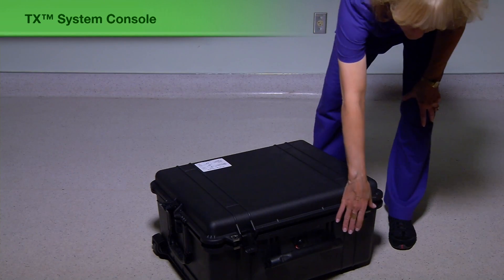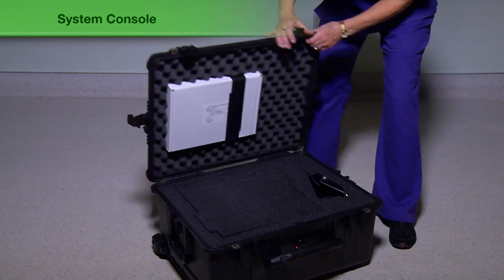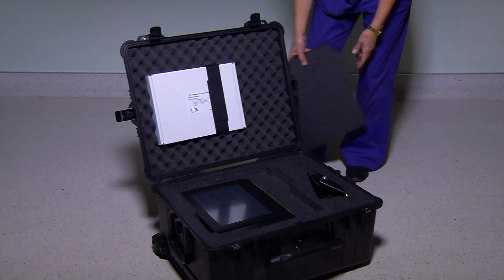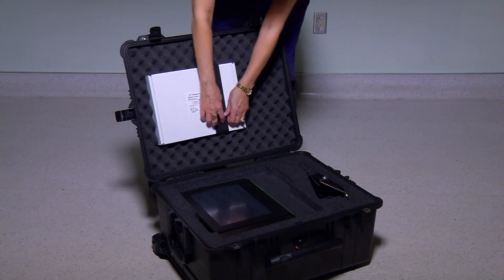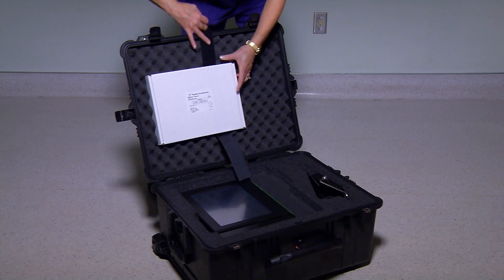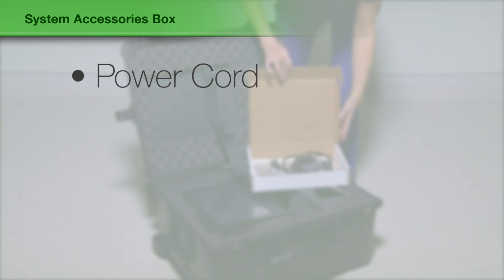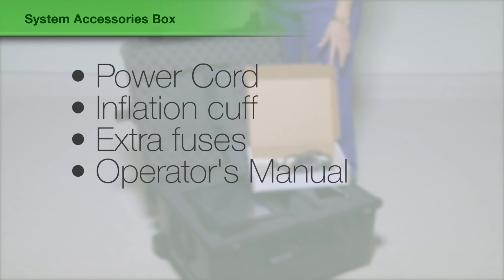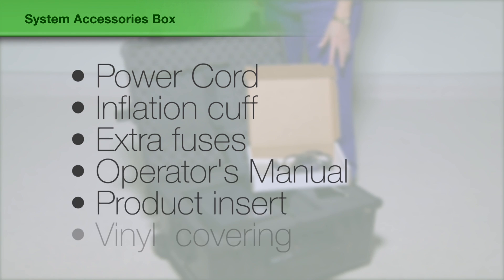The 10X Health TX system was designed for quick and easy setup and programming. The TX system console comes in a travel case with the following components: a console and a foot pedal. In the system accessories box, you will find a power cord, a reusable inflation cuff, extra fuses, an operator's manual, system setup card, and a protective vinyl covering for the console.